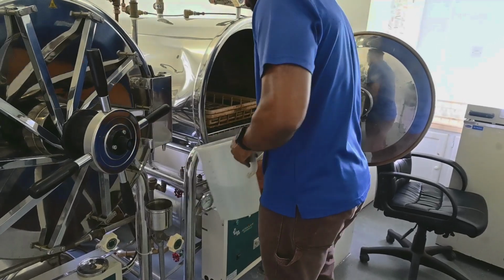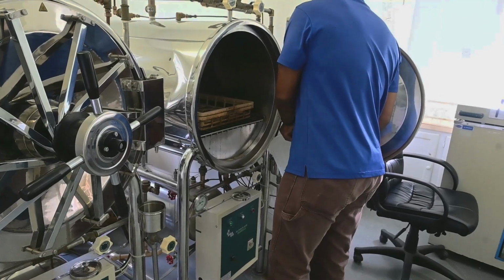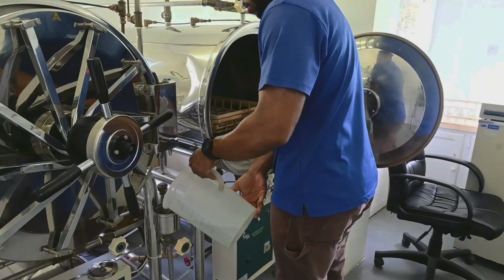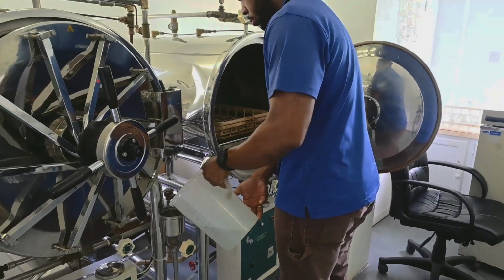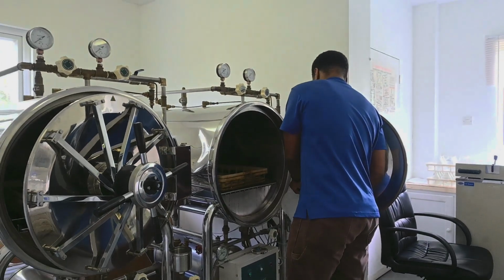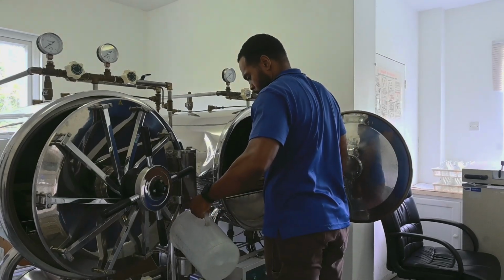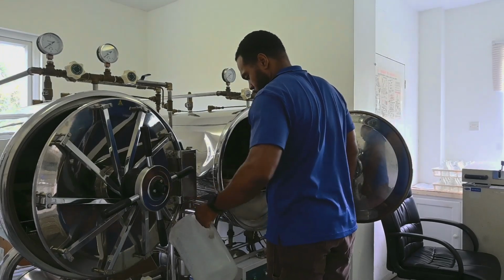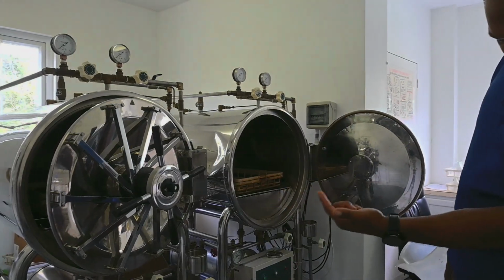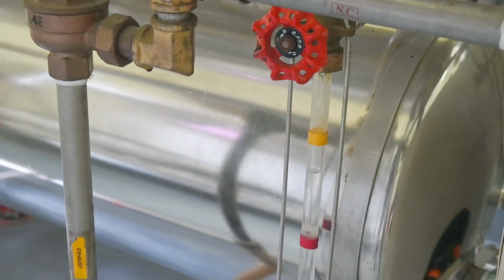Takes about maybe a little over 10 liters of water to fill both of them. So this is the water gauge.